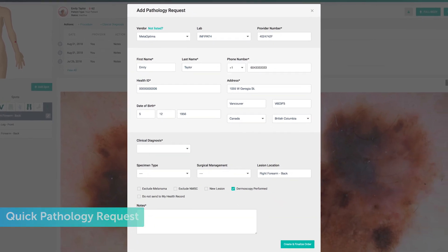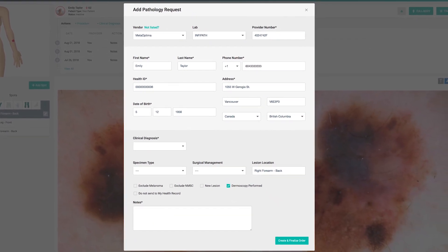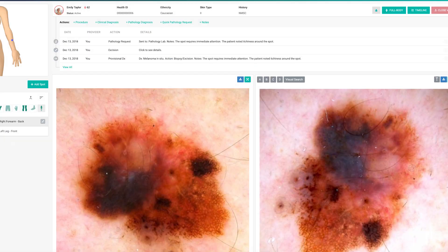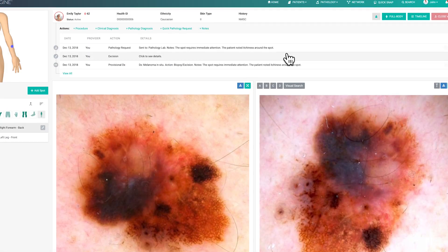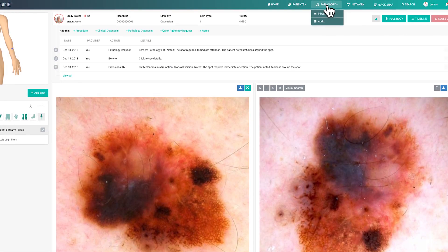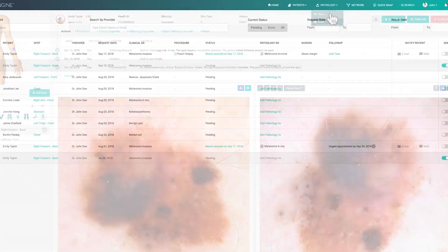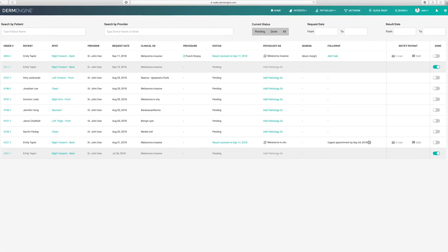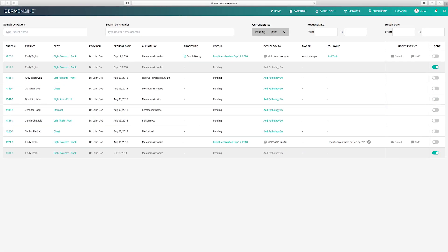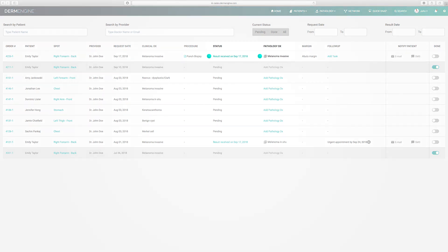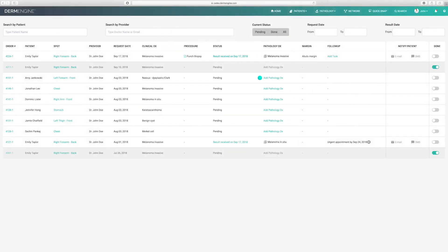Now, let's head over to your pathology inbox to see what this all looks like. Simply click pathology inbox at the top of the page. Here, you can view all of the patient's information relating to their pathology report. If your lab is synced with DermEngine, the pathologist will be able to update the status and diagnosis for you to see automatically. If not, you can manually add a pathology diagnosis.